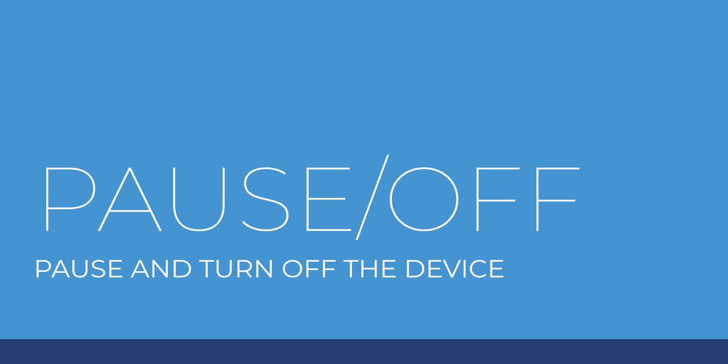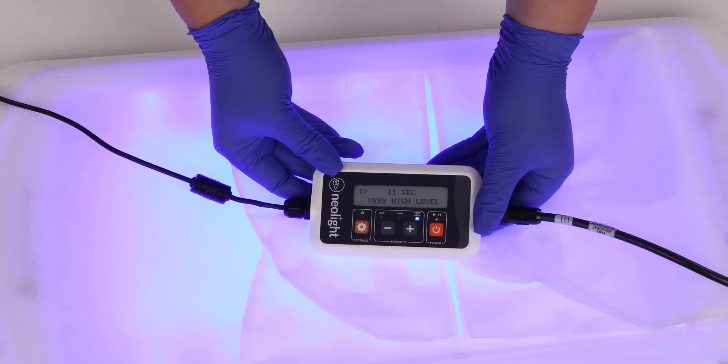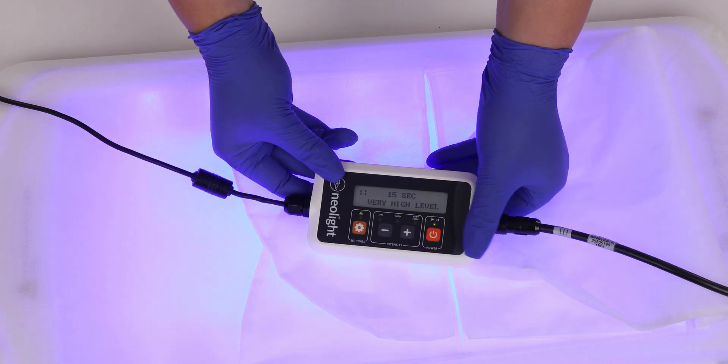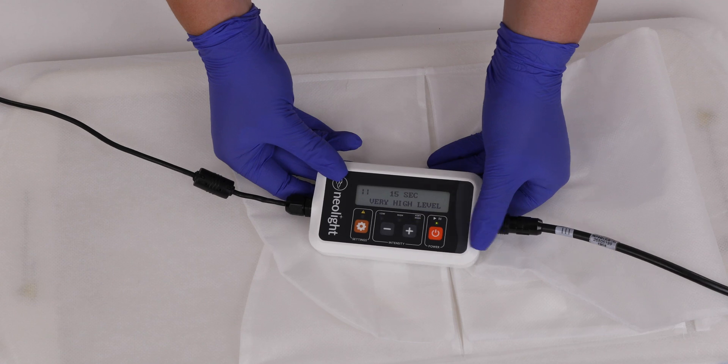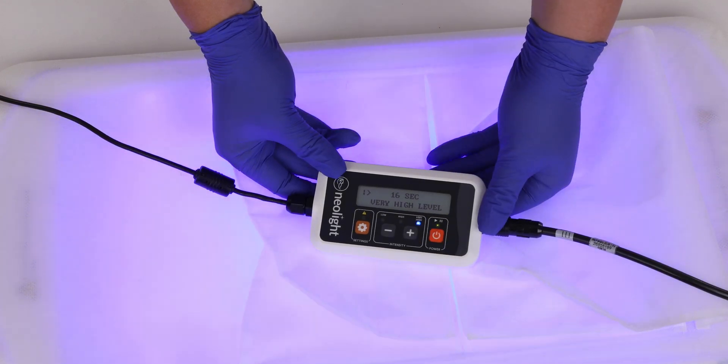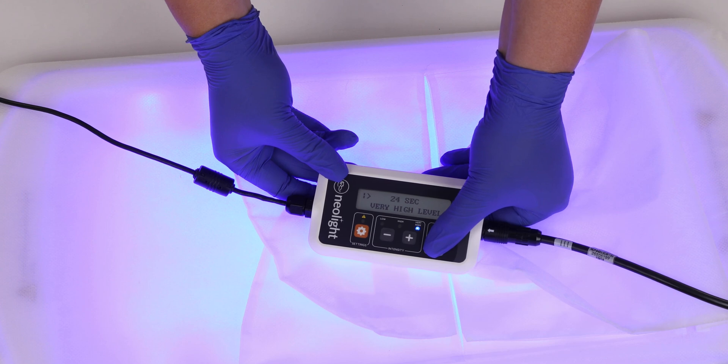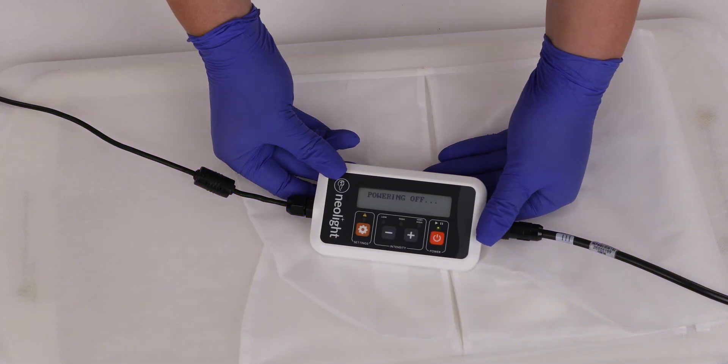When caring for your baby, you can simply pause the phototherapy treatment. To pause treatment, press the power button once. To resume treatment, press the power button once again. To turn off the device, press and hold the power button until the display turns off, which signifies the Skylife device is turned off.